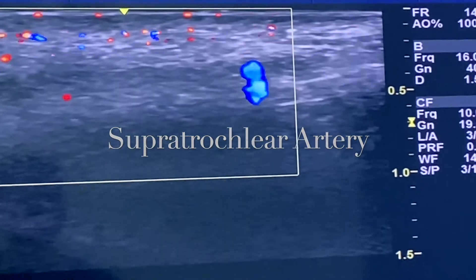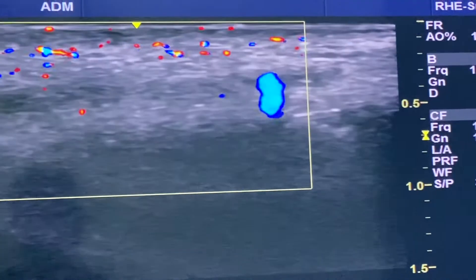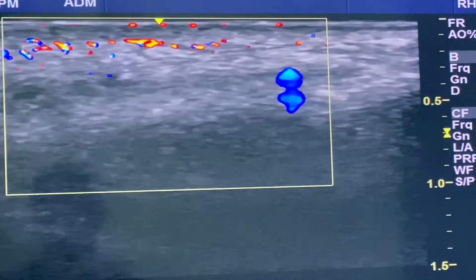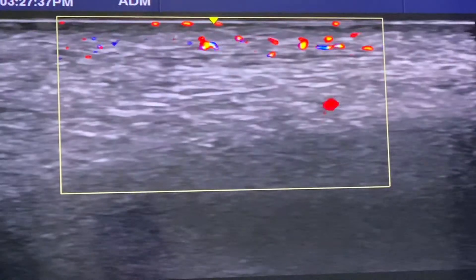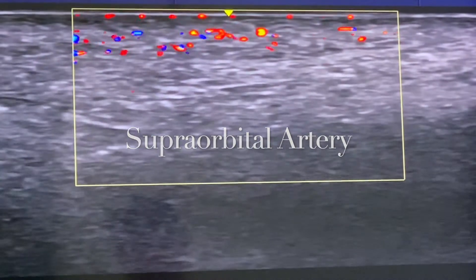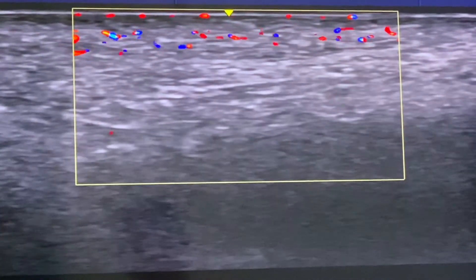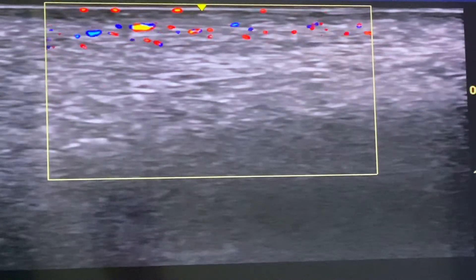Right now we're looking at the supratrochlear artery, which is on the right side of the box, coming over the orbital rim at around five millimeters. And now we're looking at the supraorbital artery, also on the right side of the box, coming over the orbital rim.